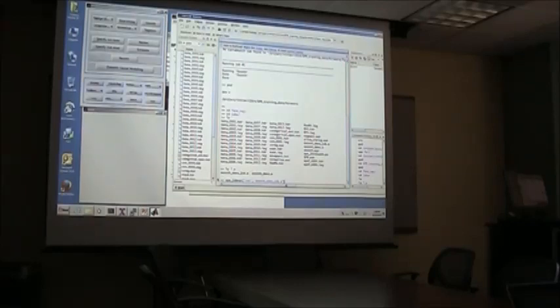This is a little beyond what's in the training data, but it gives you an intuition of how you can make this whole process a lot faster, which at some point is something you really want to do.